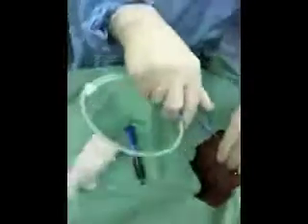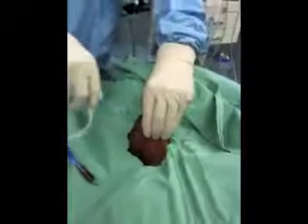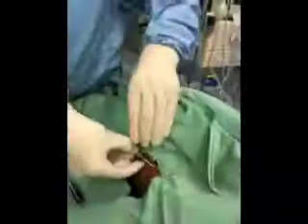How fantastic is that? You know you're in — you get a flashback — then using a normal Seldinger technique, we're feeding the wire down, just a guide wire down, and then a dilator will go over it. Watching the monitor, of course, making sure we haven't put the guide wire too far down to cause any ventricular ectopics.